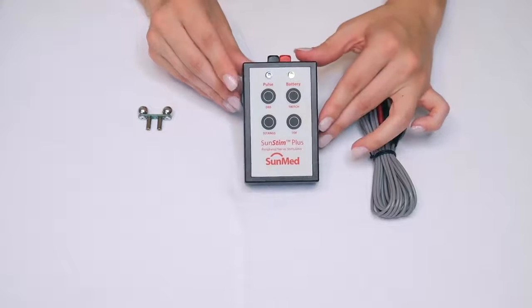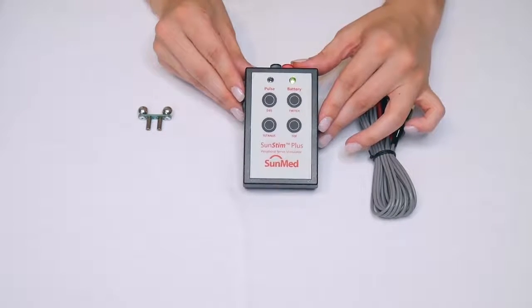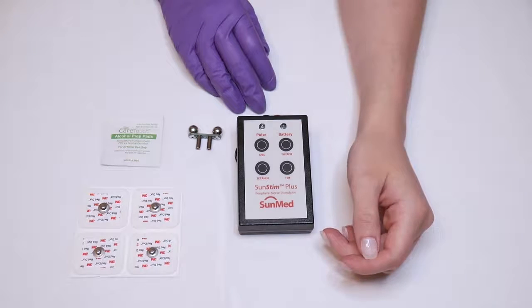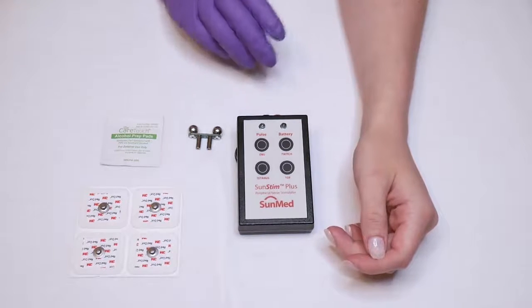Be sure to reference the IFU for detailed information on each mode. Prior to use, make sure to read and understand the provided instructions for use.